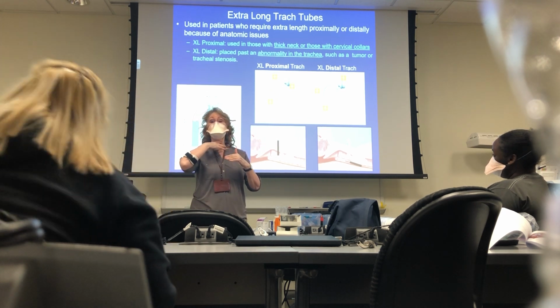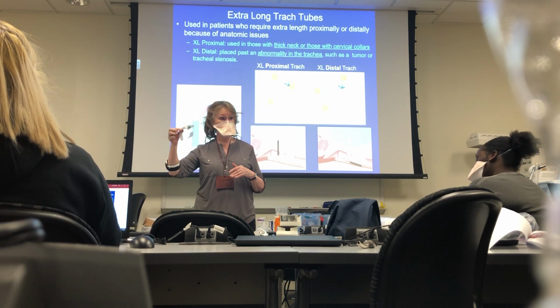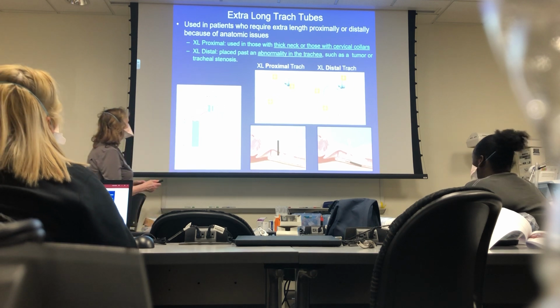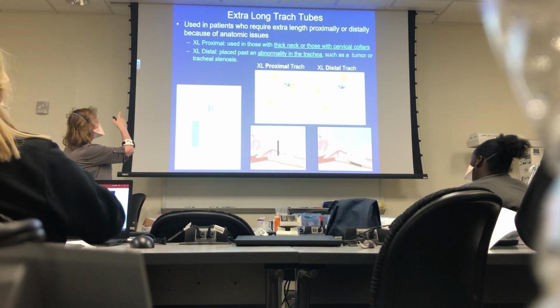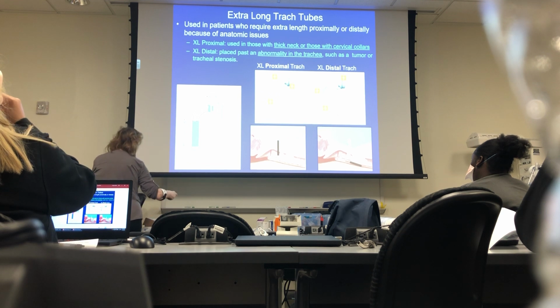Also true if somebody has some sort of tracheal anomaly and you feel you need a longer trach, then you would get the extra long distal. Make sense? That's the only thing that's different on these tubes. So, extra long trach tubes. We have the XL proximal used with people with a thick neck, XL distal if there's an abnormality in the trachea.